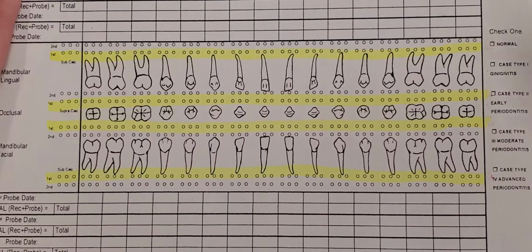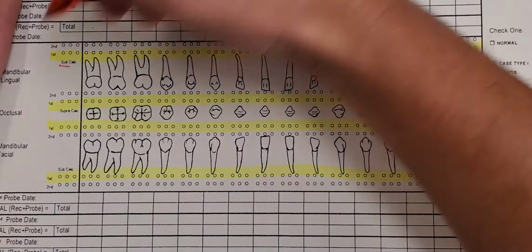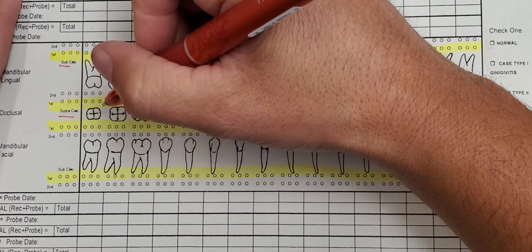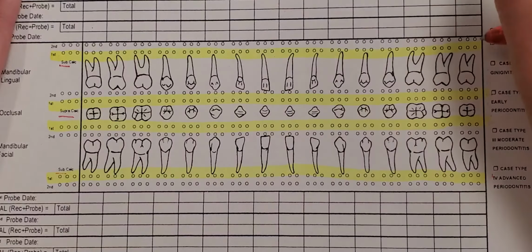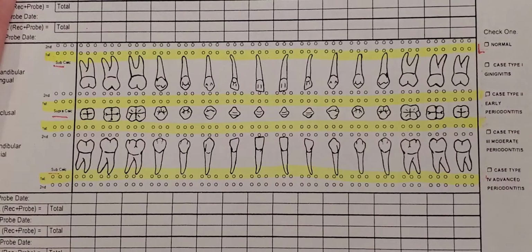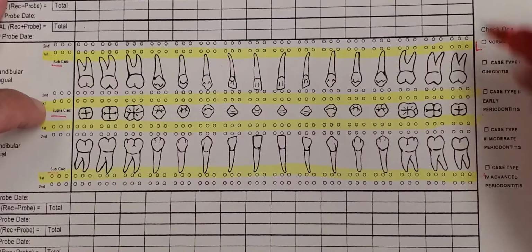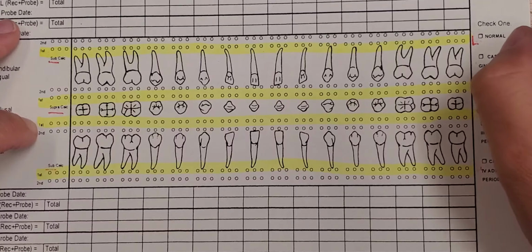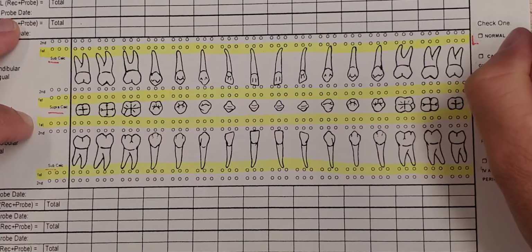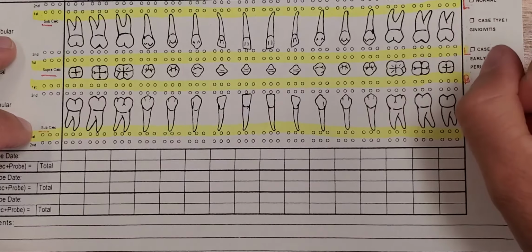The next thing you should be aware of is there is a place to chart subcalculus. Supra is the middle two rows of circles, and then sub again. Also, you want to remember that this is your lingual. So this line is for lingual sub. This line is for lingual supra. The next line, buccal supra. And the next, buccal sub.